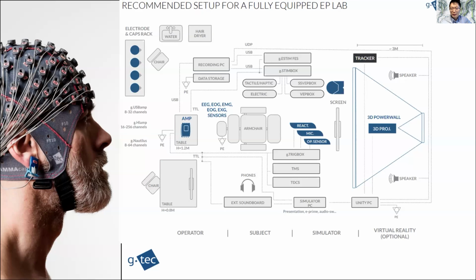So let's visualize the lab setup. The subject sits in the center room in the armchair wearing the EEG cap, and we will record a 32-channel EEG simultaneously with an 8-channel fNIRS. The experiments represent different visual and auditory stimuli, and require powerful software for real-time processing and offline analysis. We also want the whole system to be mobile with the flexibility to add other biosignals like ECG, EMG, GSR for future projects. To make this happen, I will summarize the key requirements in bullet points, and then we can jump into the g.tec Configurator to select the right equipment.